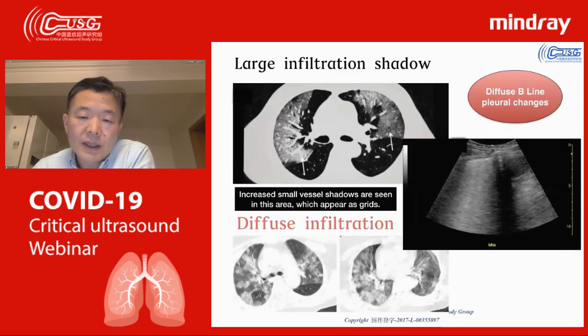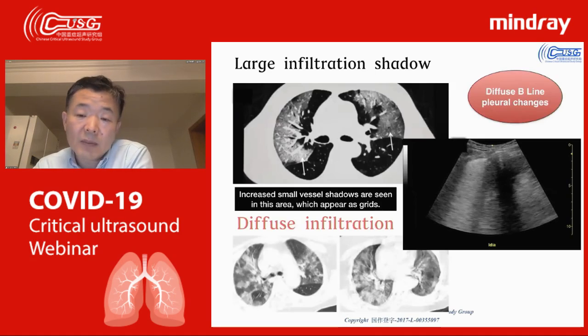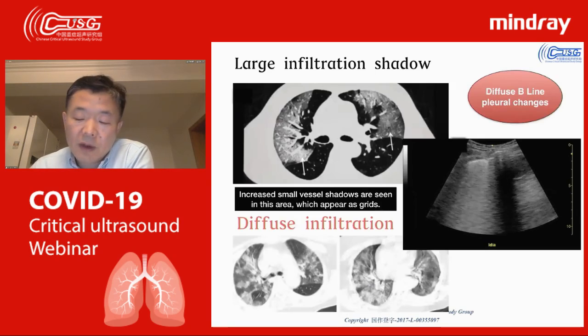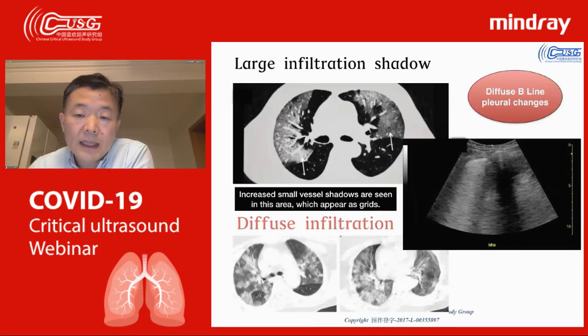The lung ultrasound is the same, just the area you see, maybe only the lower left side of your lung, may become the whole lung. You can see the same image on your lung ultrasound, this kind of lung sliding and B-lines.